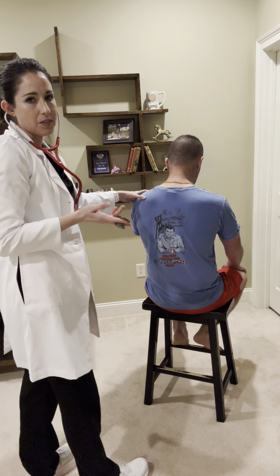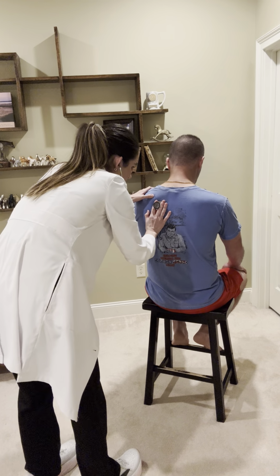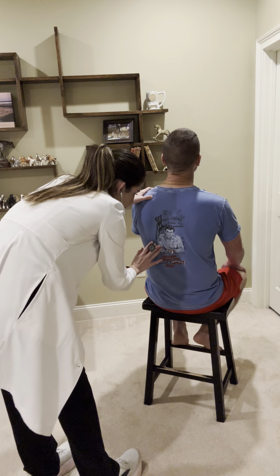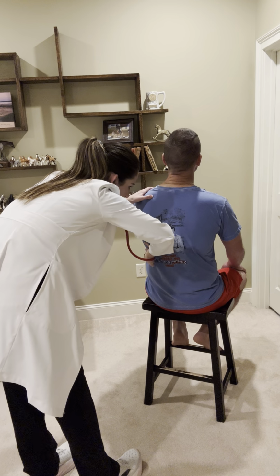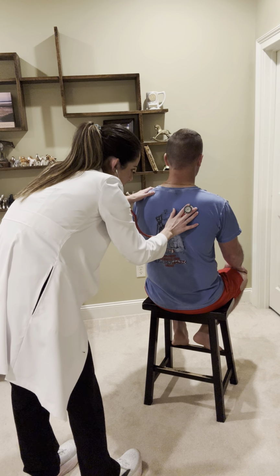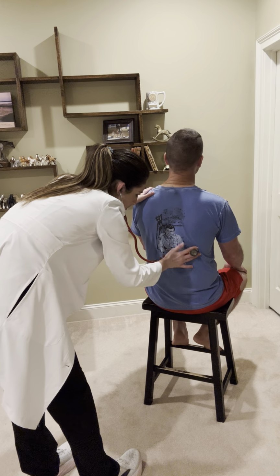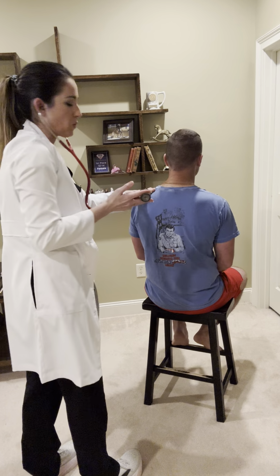All right, then we are going to auscultate for egophony. Say E every time I touch. E, E, E, E. Okay, bronchophony is what we'll auscultate for. Say 99 every time I touch. 99, 99, 99, 99. And for whisper pectoriloquy, whisper 99.